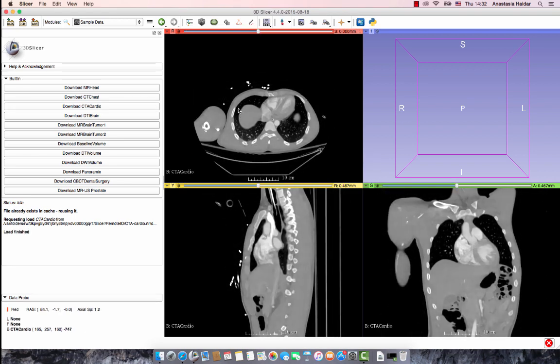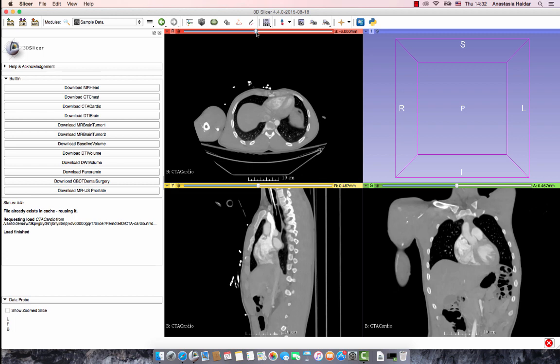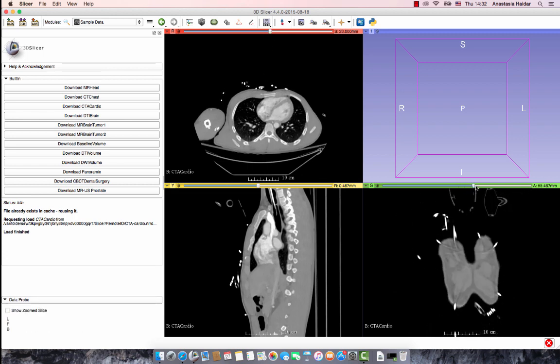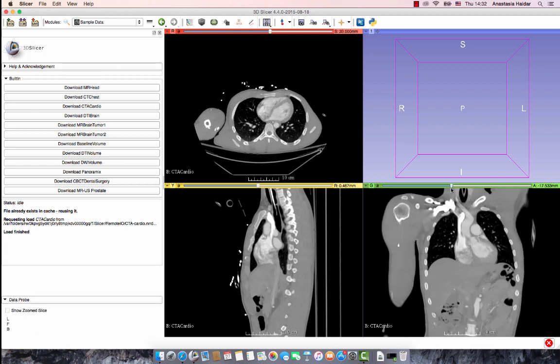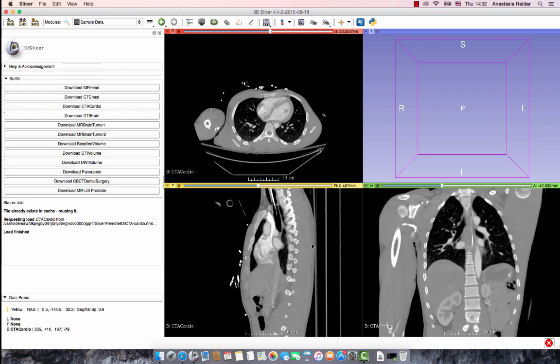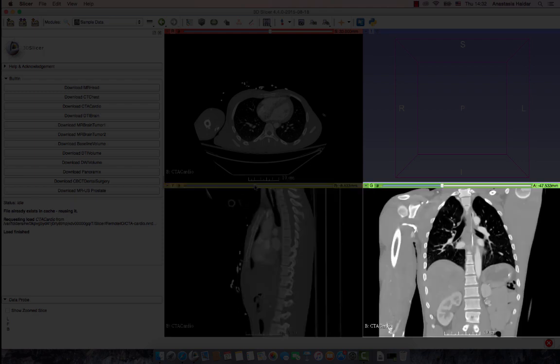Once the slices load, you can change the contrast and brightness by left clicking your mouse and dragging it up and down. Above is the bar of your arrow keys to view each slice individually. In the layout, you can observe the different views of the vertebrae in the red box, the yellow box, and the green box. The red represents the axial view, the yellow represents the sagittal view, and the green represents the coronal view.